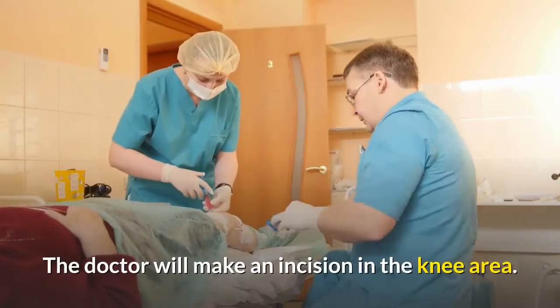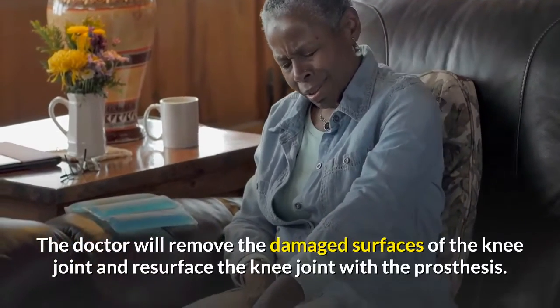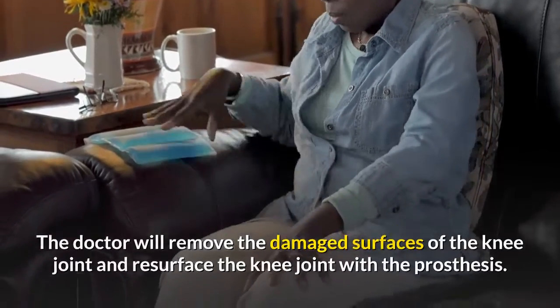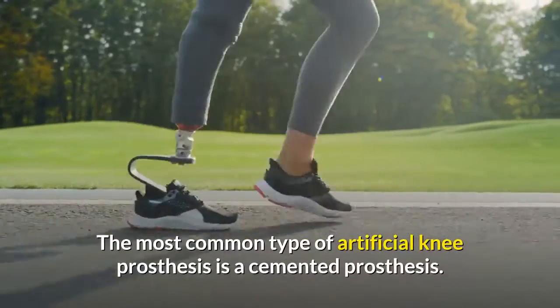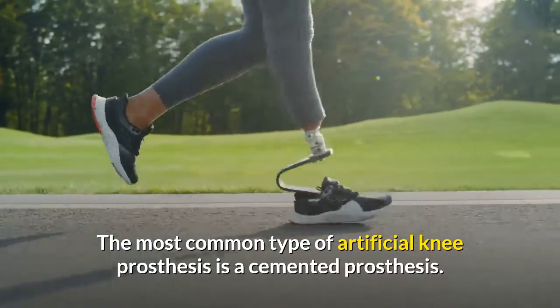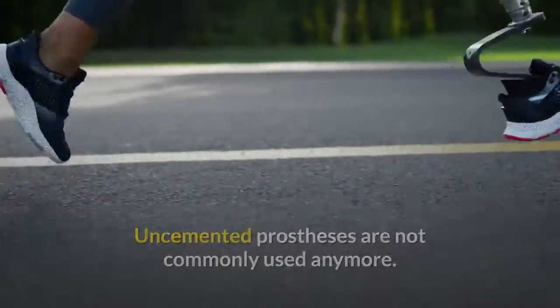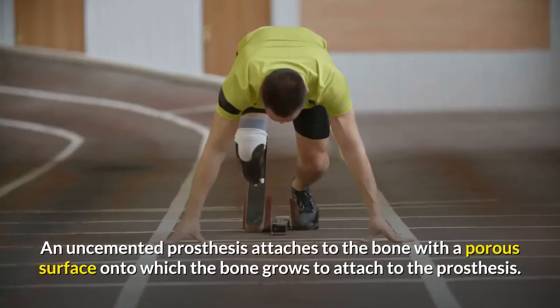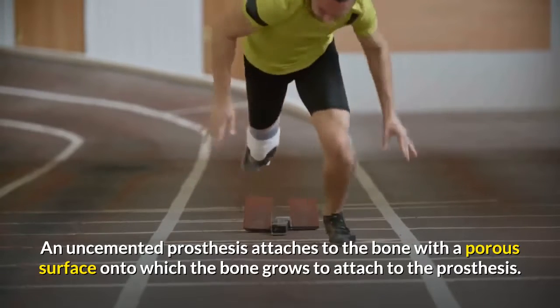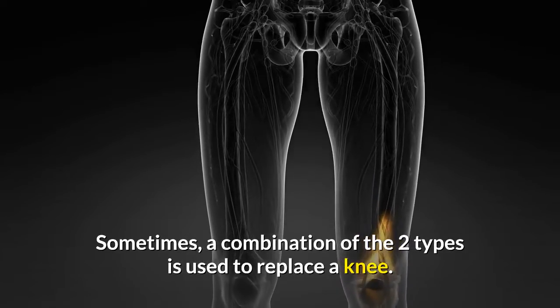The doctor will make an incision in the knee area. The doctor will remove the damaged surfaces of the knee joint and resurface the knee joint with the prosthesis. The knee prosthesis is made up of metal and plastic. The most common type of artificial knee prosthesis is a cemented prosthesis. Uncemented prostheses are not commonly used anymore. A cemented prosthesis attaches to the bone with surgical cement. An uncemented prosthesis attaches to the bone with a porous surface onto which the bone grows to attach to the prosthesis. Sometimes, a combination of the two types is used to replace a knee.